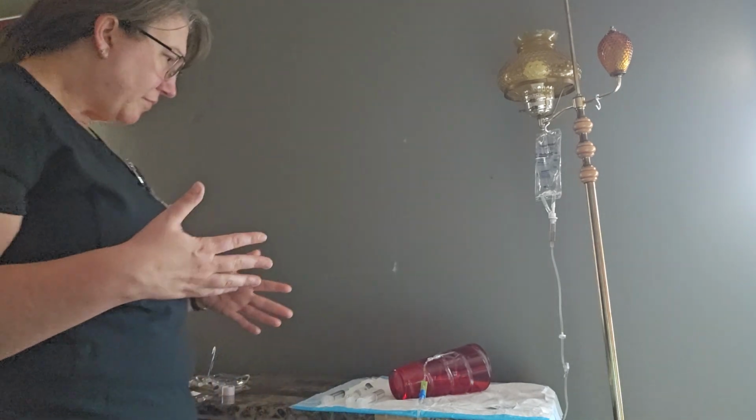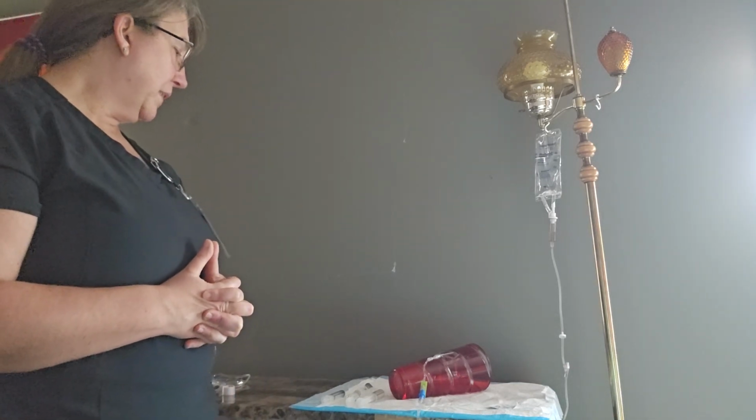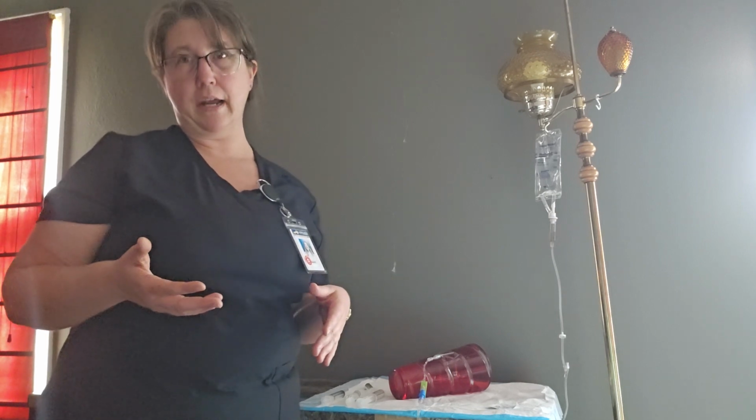So I'm going to gather my supplies, and part of gathering the supplies is gathering that medication. Depending on what facility you're at will depend on how that medication will come. It may already come in a syringe ready for you to administer, or you might have to draw it up in a vial. It just depends on where you're at.